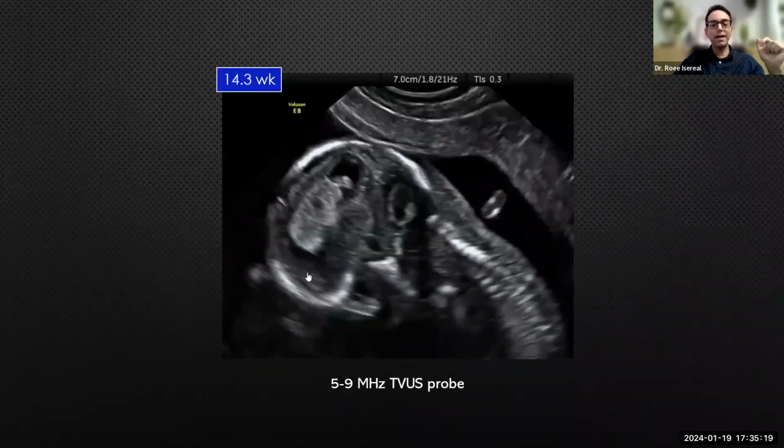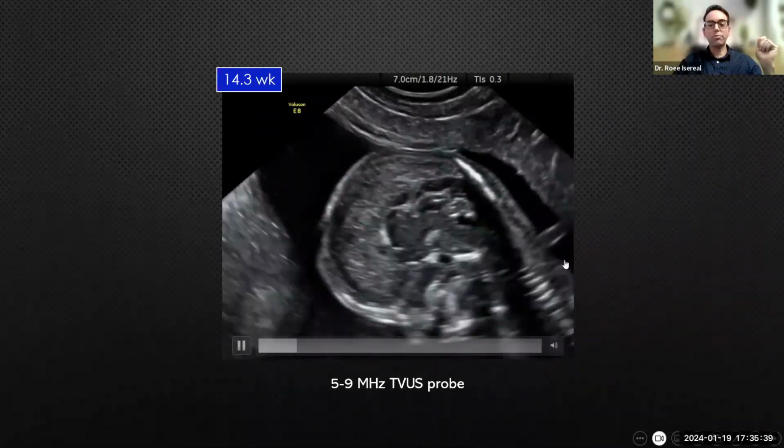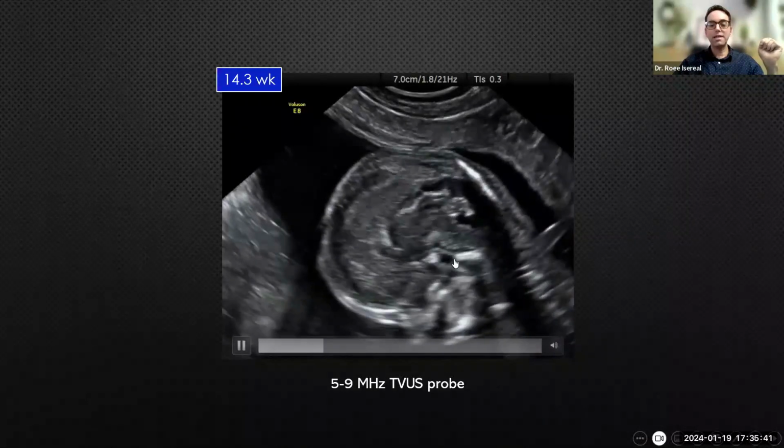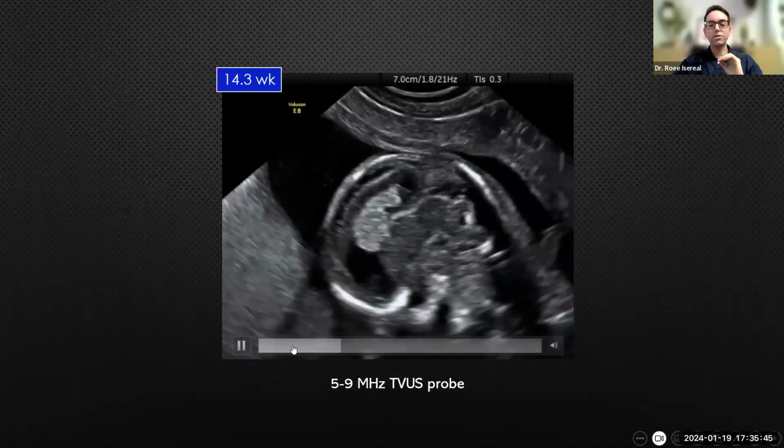Now, how does it look on the live scan? And purposely, I put this video because it's quite an old video. It's a transvaginal probe, but it's a low resolution, normal standard resolution. This is not one of the new fancy transducers. And I would like to show you that if you're performing a good technique, even the basic transvaginal probes will do the job. You can see very nicely here that when I'm scrolling through the mid-sagittal plane, I will take the image a little bit backwards.